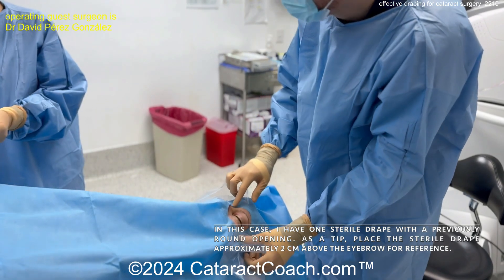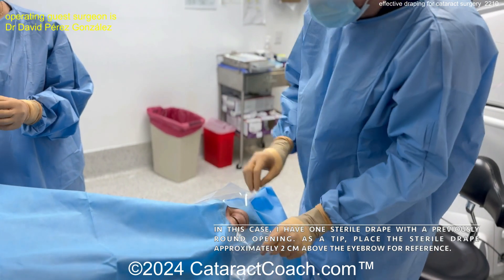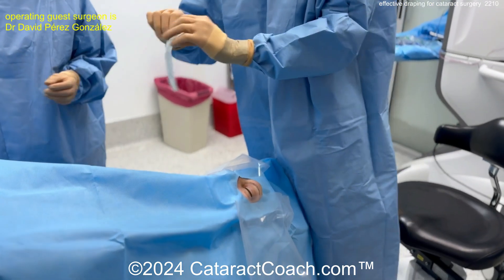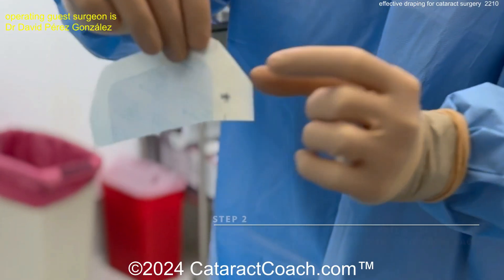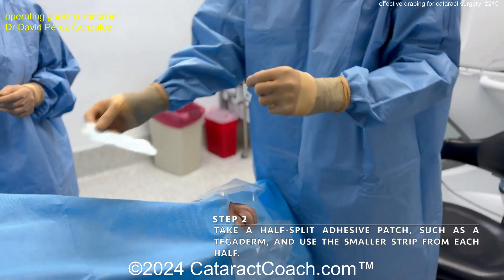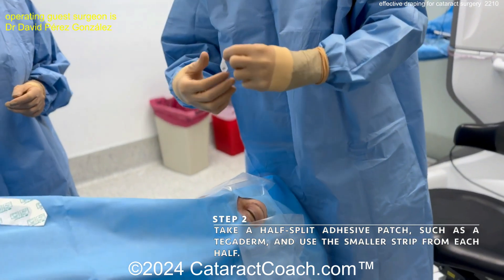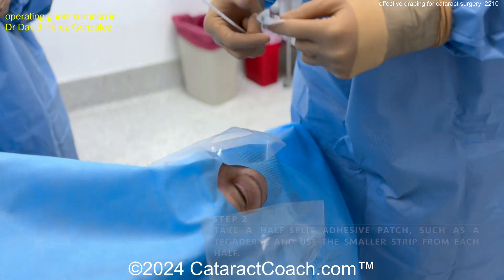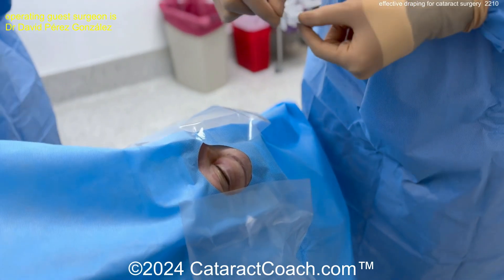There's the round opening. He's placing it about 2 centimeters above the eyebrow for reference, he says. Now look at this — so interesting. He's using a Tegaderm, and he's using an edge of the Tegaderm to help lift the lashes up and lift the eyelid up. I also like to use the Tegaderm in the way I drape the lashes.